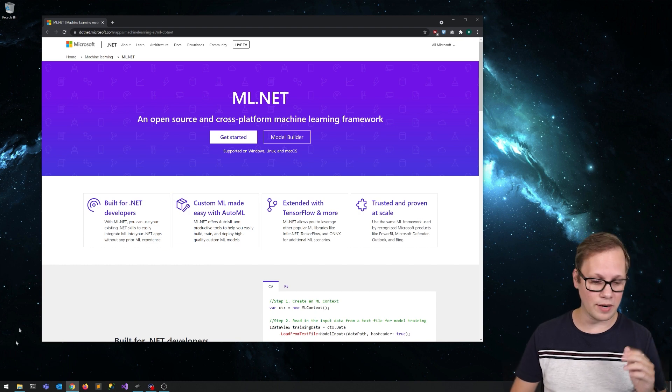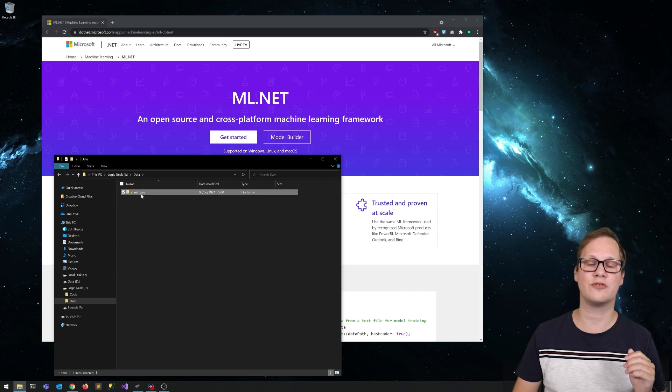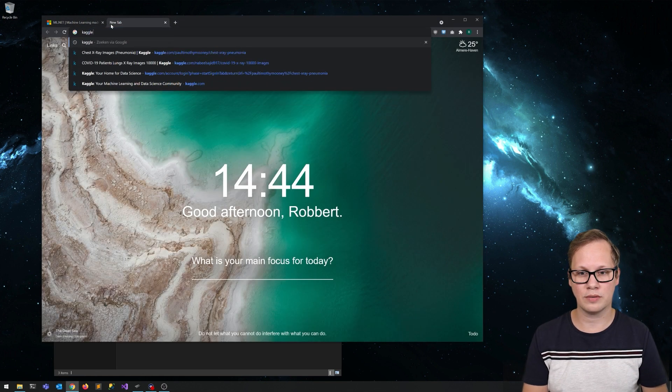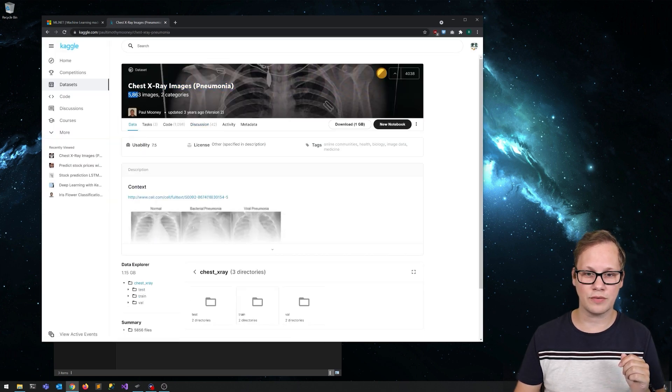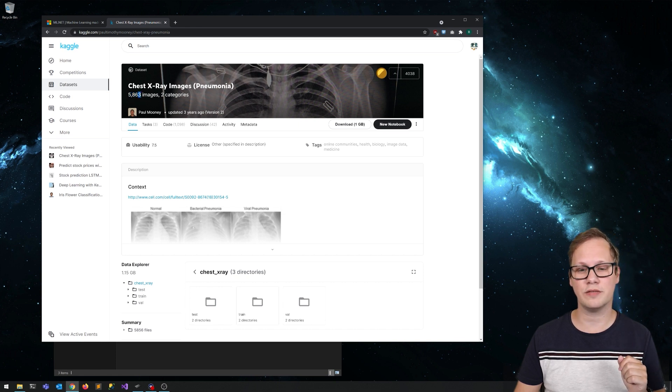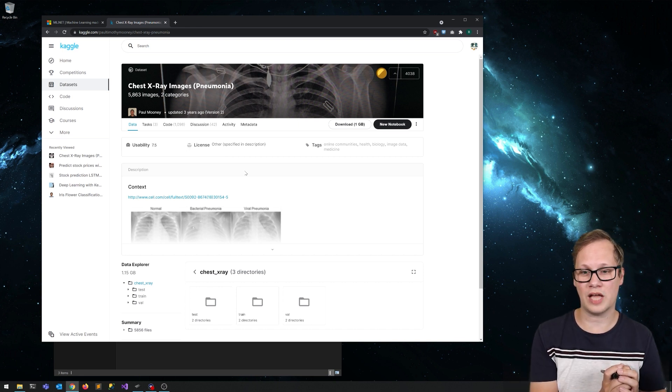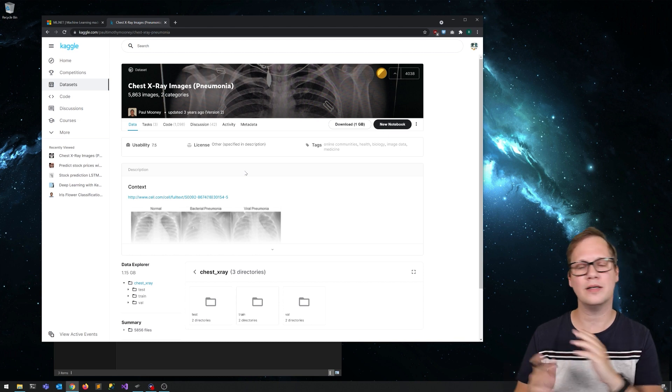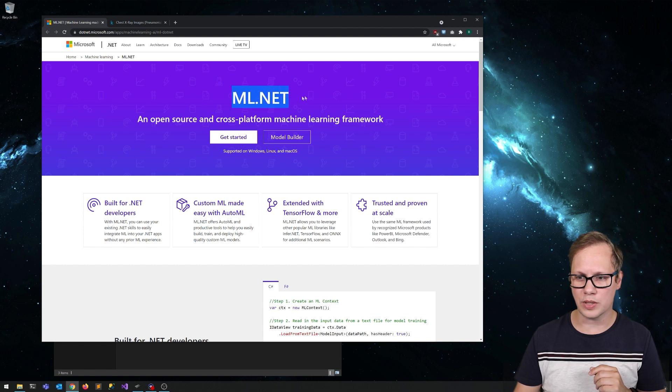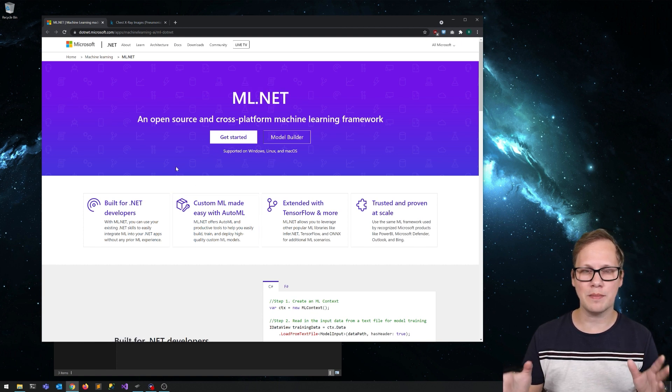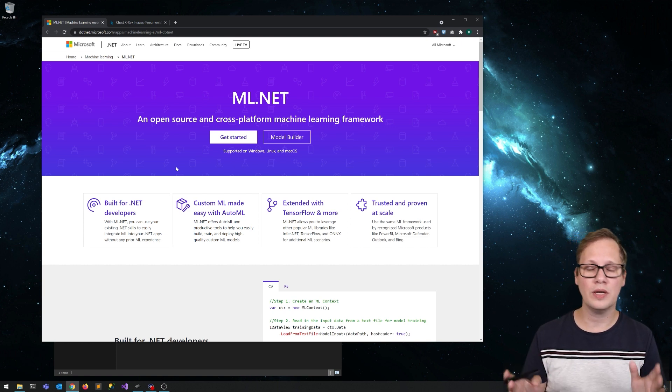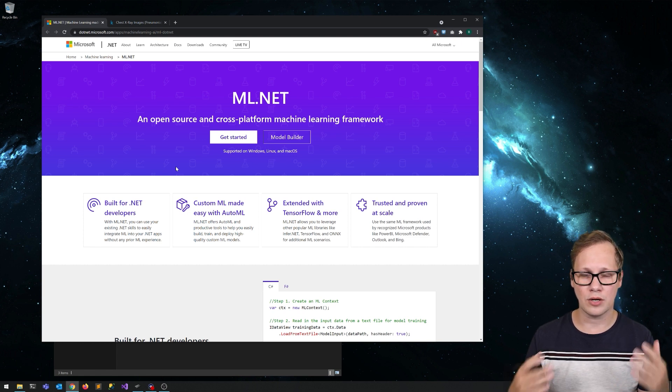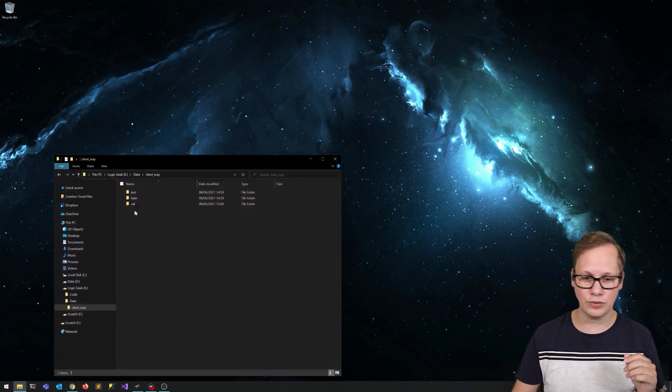So what I've done is I've downloaded this data set, the chest X-ray data set. You can download it from Kaggle. It's a collection of 5,863 images divided in two categories: either a normal chest X-ray or pneumonia chest X-ray. What we want to do is use ML.NET in combination with AutoML to see if we can make a model that you can feed a chest X-ray, and then it tells you whether or not the patient has pneumonia. I think that's really cool. So let's try that out.